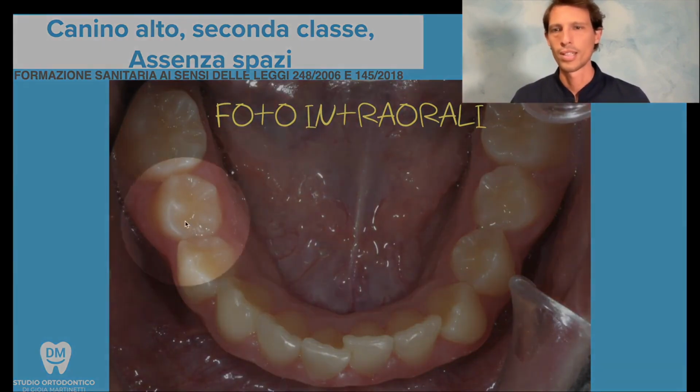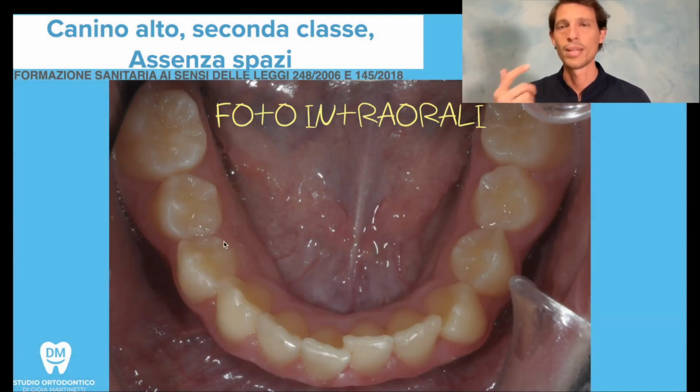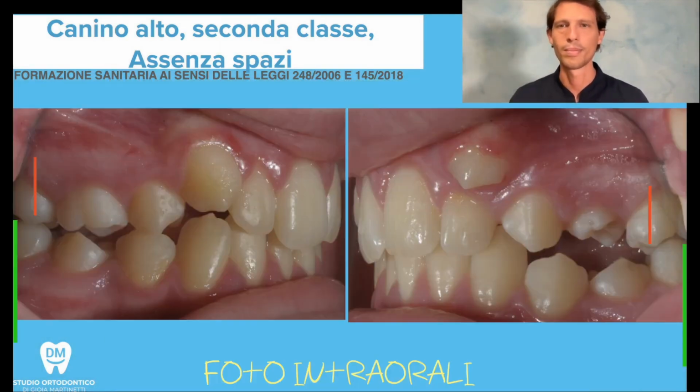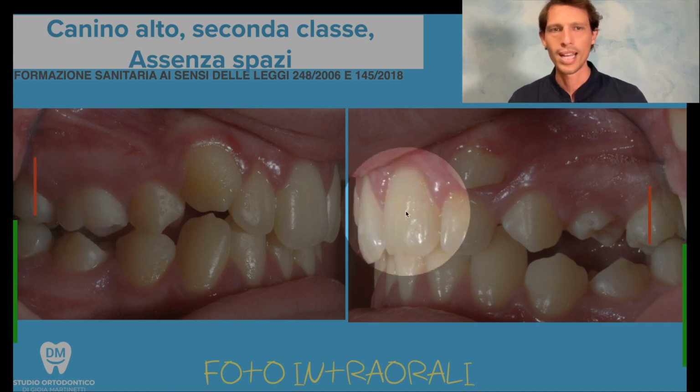On the bottom, the issue is simpler. The teeth are just a bit misaligned. So we simply need to realign them. Let's take another look. The upper teeth are all ahead of the lower teeth.